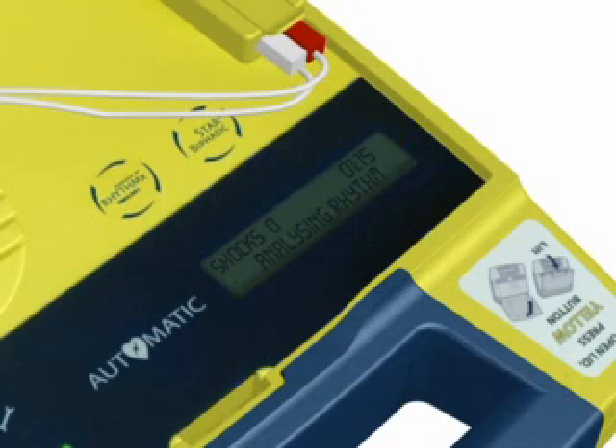Do not touch the patient — analyzing heart rhythm. Please wait. Do not touch the patient — analyzing heart rhythm. Please wait. It is now safe to touch the patient.